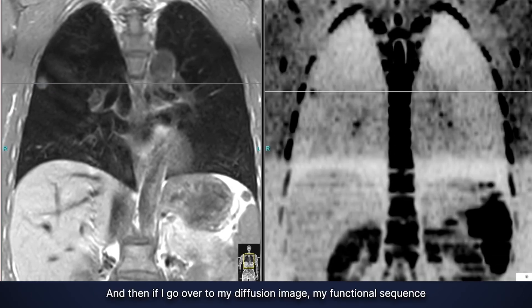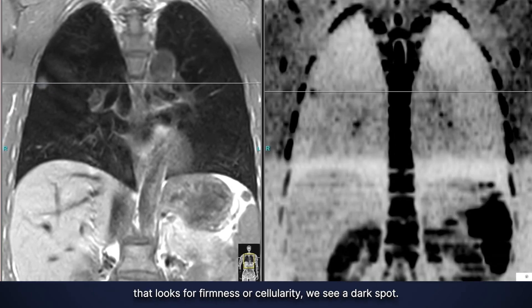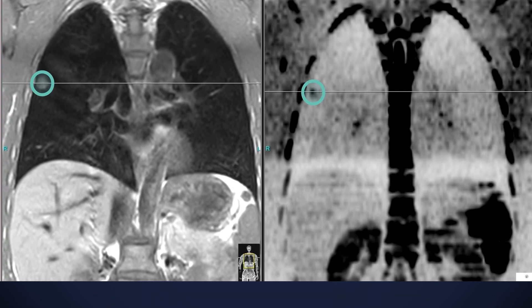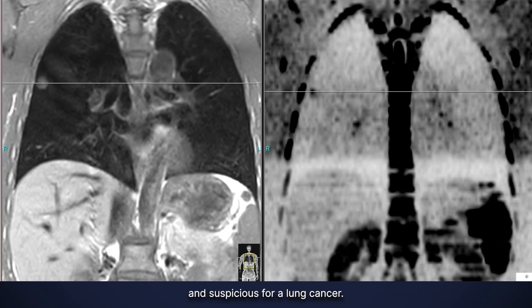If I go over to my diffusion image — my functional sequence that looks for firmness or cellularity — we see a dark spot. The combination of the appearance of this mass with the diffusion findings tells me this is a concerning lesion, suspicious for lung cancer.